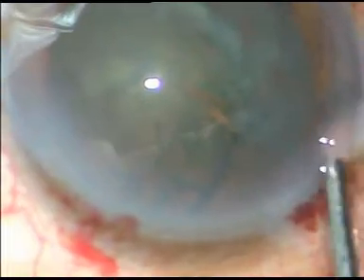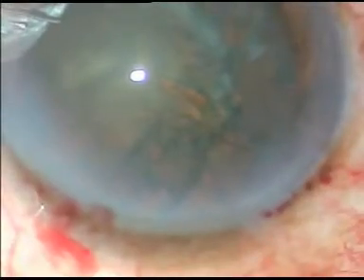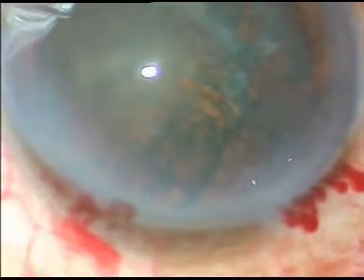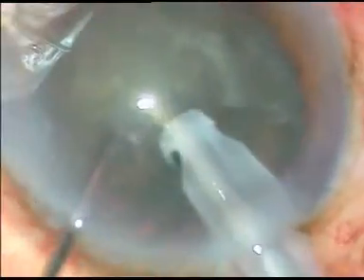Some viscoelastic is injected into the anterior chamber. Now I introduce the tip of the phaco handpiece into the anterior chamber. I embed the tip into the nucleus and hold it with high vacuum and chop it.